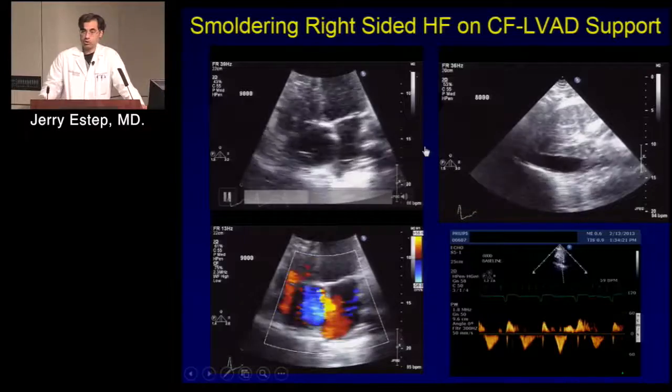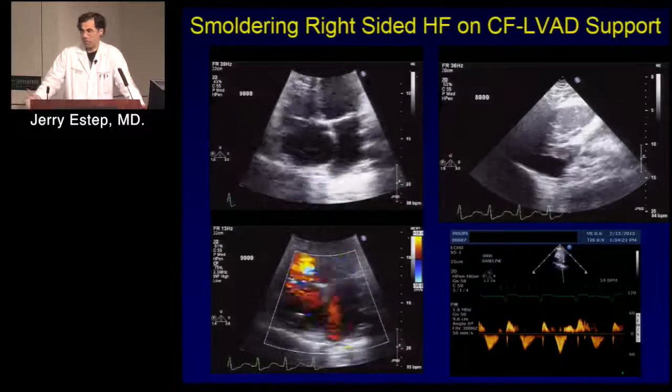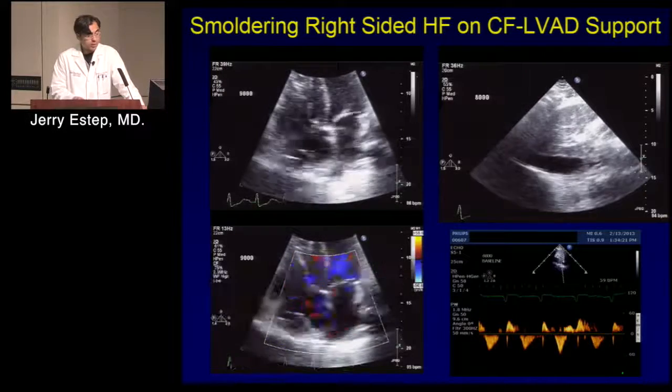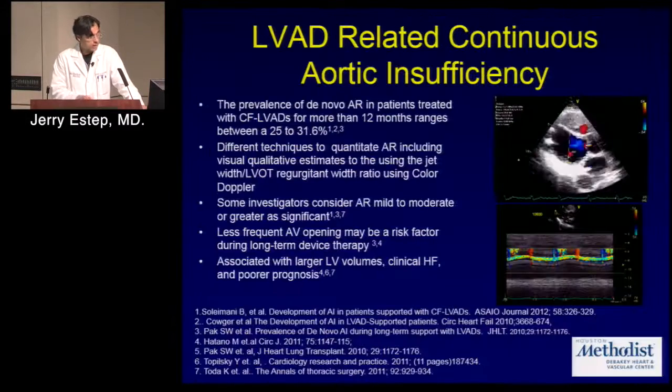It was just an unworkable situation for an LVAD and prolonged inotrope several months out. And we're seeing this phenotype more and more. So echo is helpful for us to understand that.